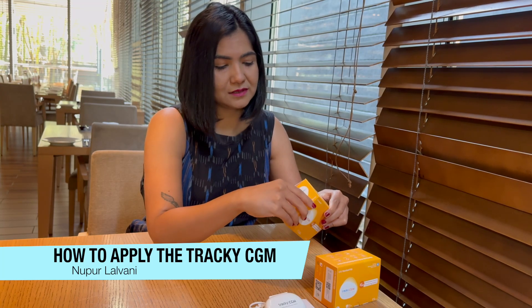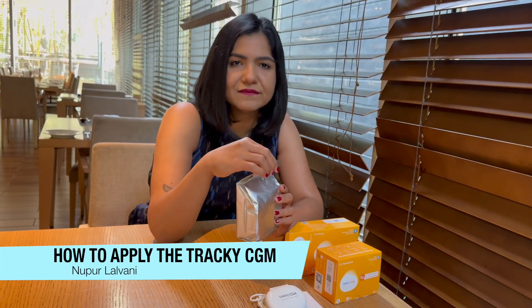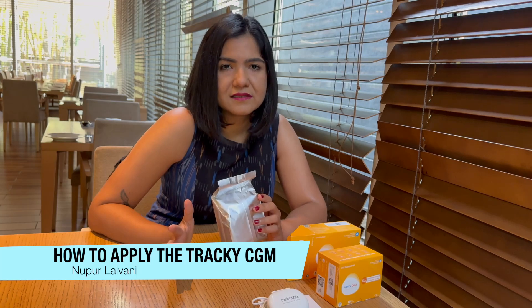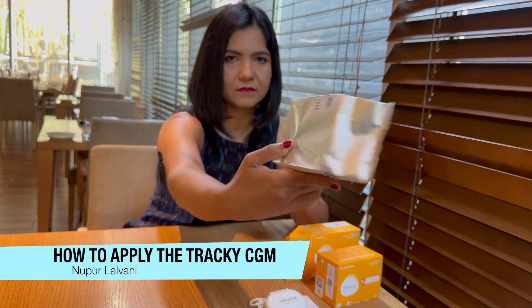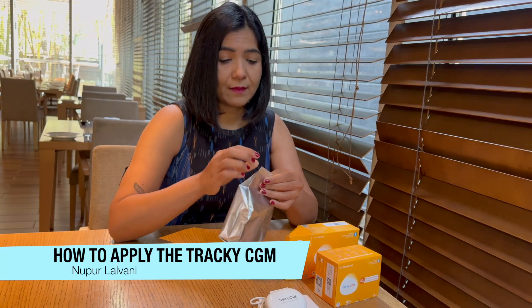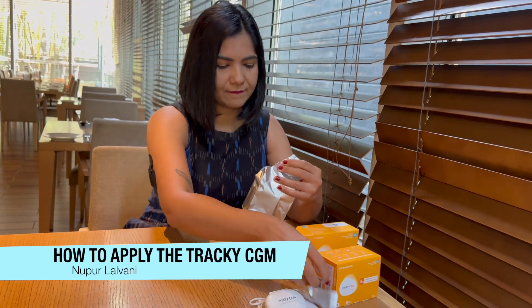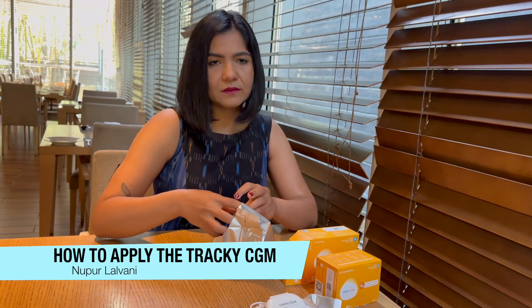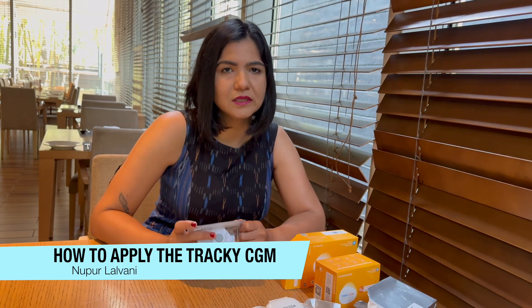Now let's open the sensor box and see what the sensor looks like. The Tracky CGM gives you readings every three minutes, which is about 480 readings in the whole day. Inside the sensor box — I'm going to open it up. The sensors work via Bluetooth, so all the hassle of having an NFC phone does not come up for this CGM, because it communicates with your phone and with the mobile app via Bluetooth.